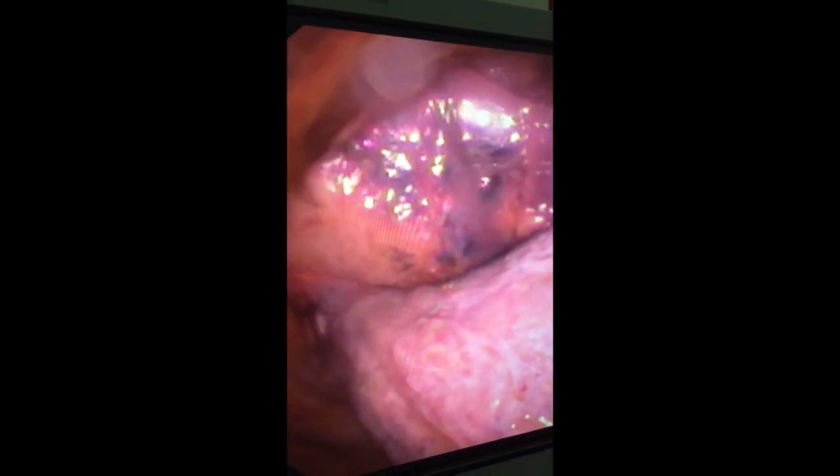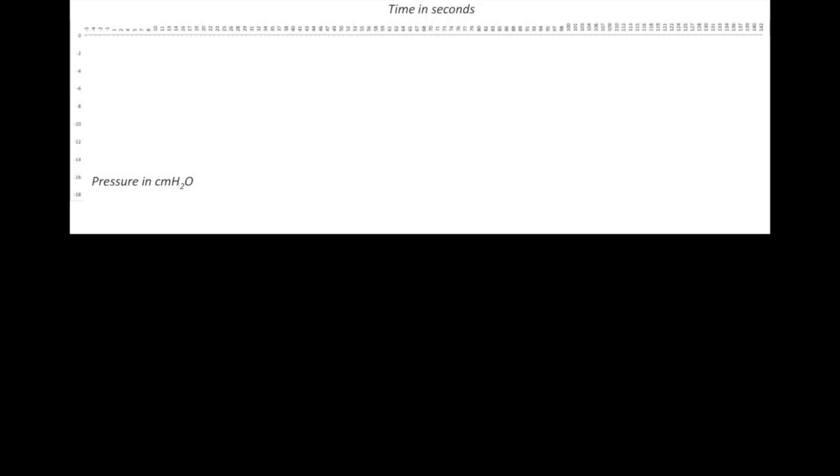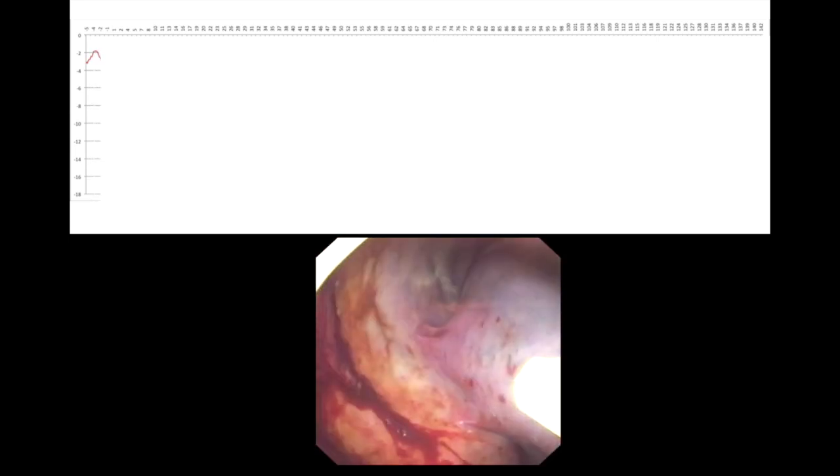In a patient such as this one who is suffering from hepatic hydrothorax, expandability of the lung is very easy to identify when subjected to negative pressure. However, in other cases where disease involves the visceral pleura, this effect might not be as obvious.